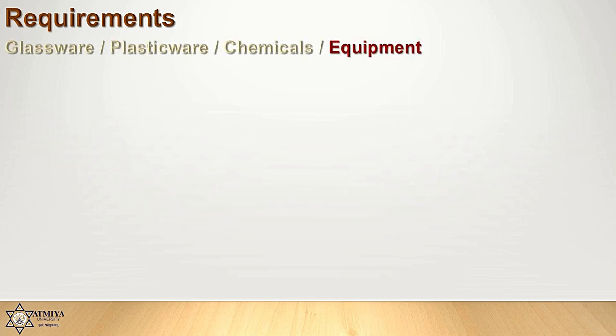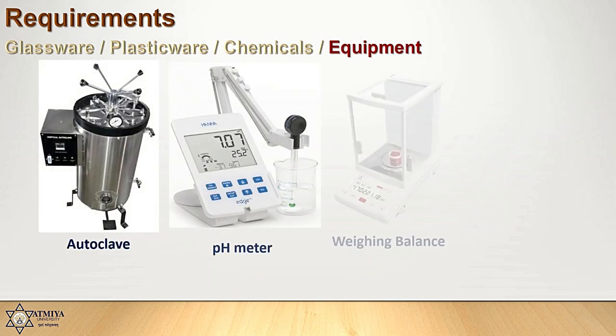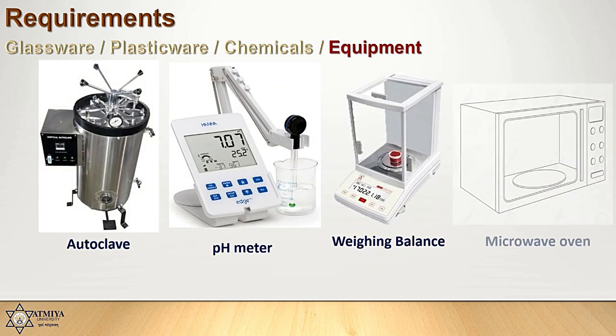Equipment requirement. The following equipment is required: autoclave, pH meter, weighing balance, and microwave oven.